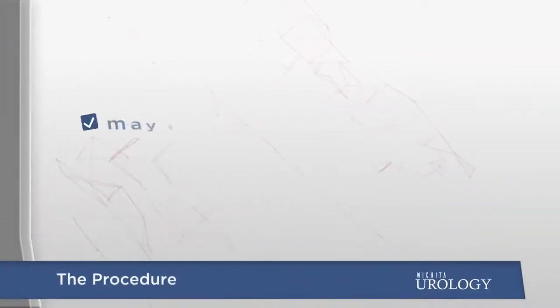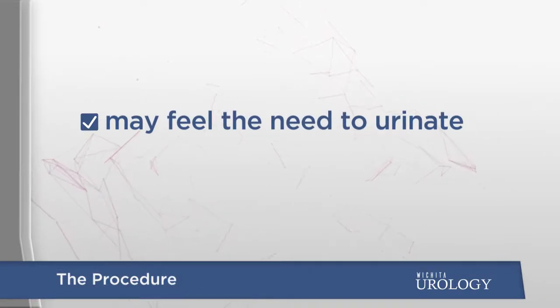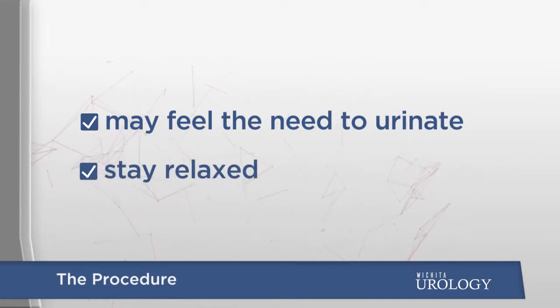In order to get a good view, the bladder will be filled with saline. A patient may feel the need to urinate, which may cause minor discomfort. The more relaxed a patient can be, the easier and less painful the procedure will be. Again, the procedure only takes about 2 minutes.